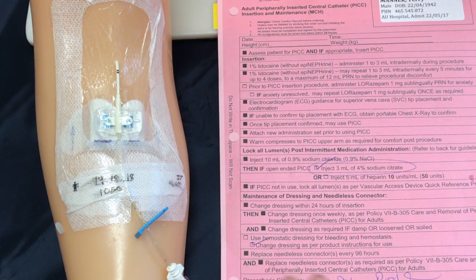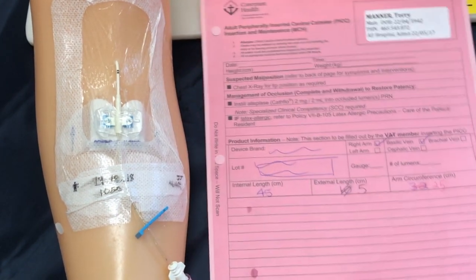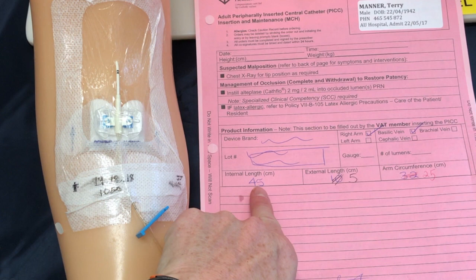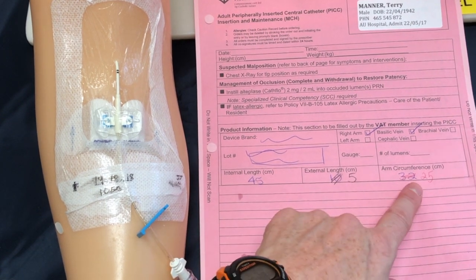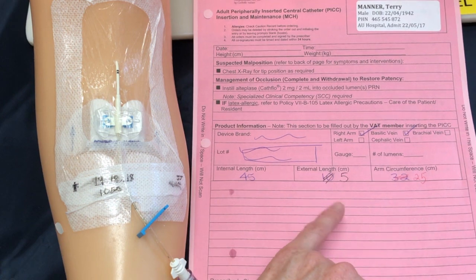Some of the data we need to complete our assessment comes from a patient information document such as this PICC insertion record. This is a sample and the numbers won't match what we'll find in our assessment, but what I want you to locate are the internal and external lengths as well as the arm circumference — we're going to be assessing those at the bedside.